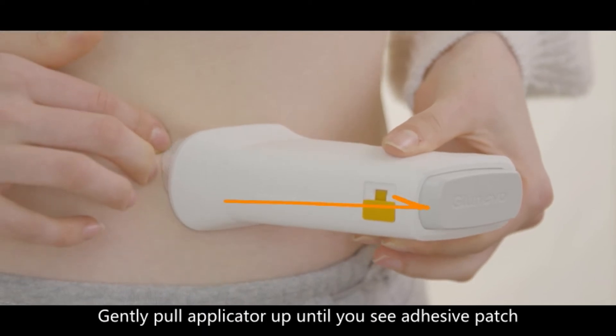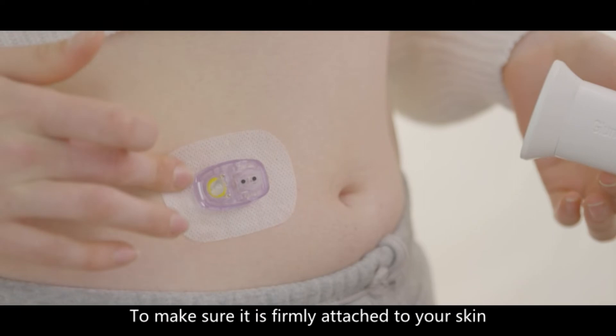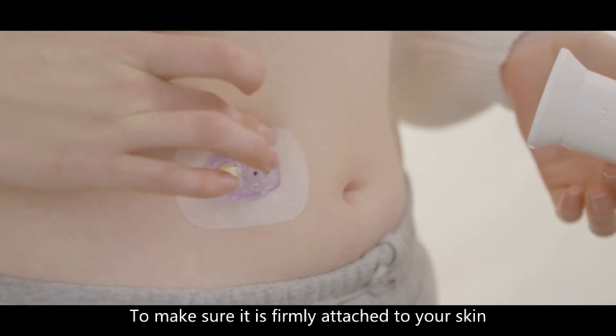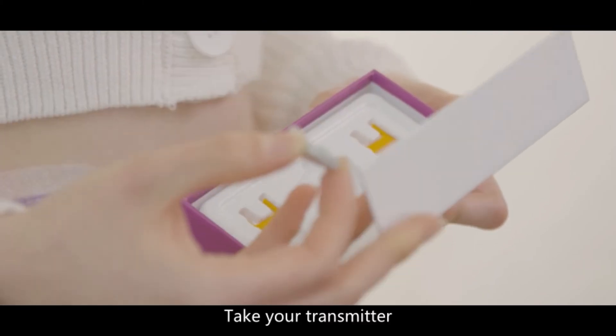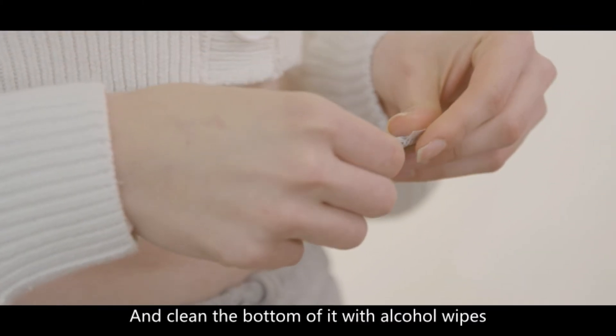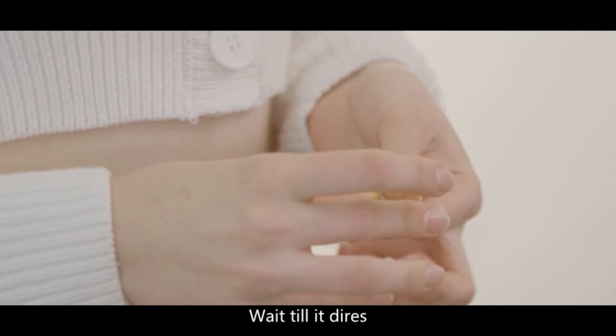Gently pull the applicator up until you see the adhesive patch. Press the sensor and run your fingers around the adhesive tape to make sure it is firmly attached to your skin. Take your transmitter and clean the bottom of it with alcohol wipes. Wait until it dries.